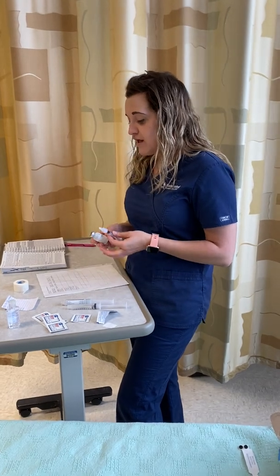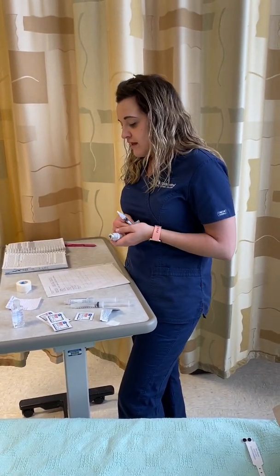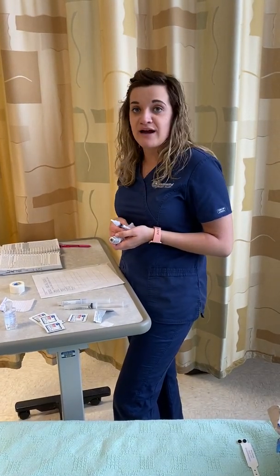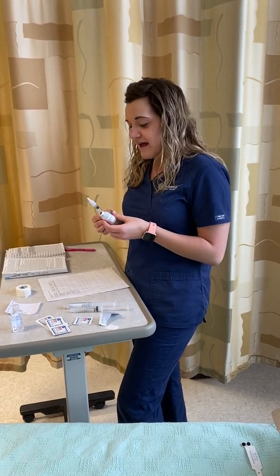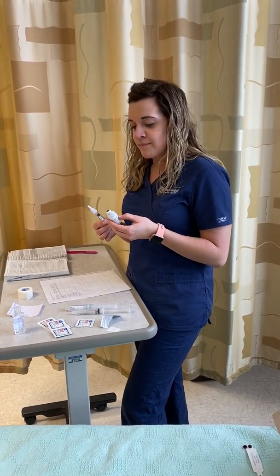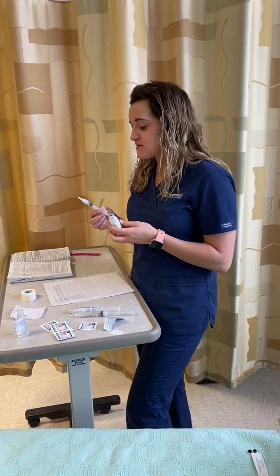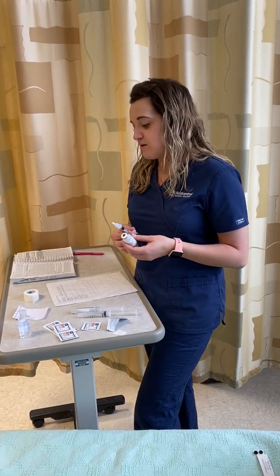So I have Mr. Bob Owens. I have hydromorphone to be given PRN, 1 milligram IV push every 3 hours for pain. He has not had it today, so we can go ahead and get that now. I have hydromorphone 1 mL per 2 milligrams. After doing my math, I know I need to give 0.5 mLs for 1 milligram IV push every 3 hours.